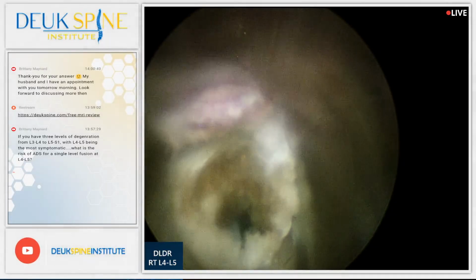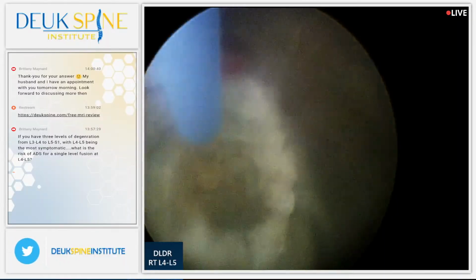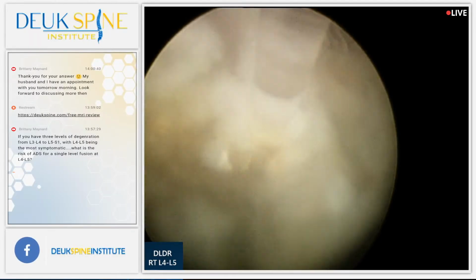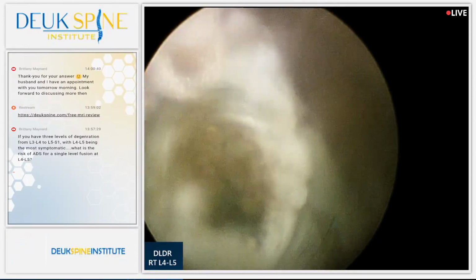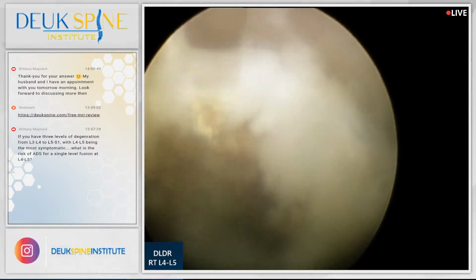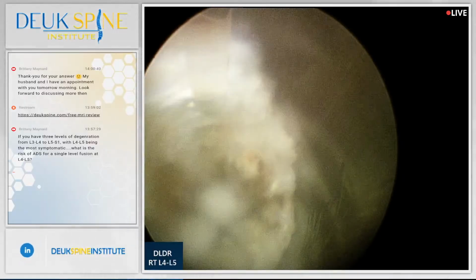this laser that we're using is made in Israel. It's now owned by Boston Scientific. Boston Scientific is a medical device company in the United States, multinational. And basically, they bought the lasers and they paid $1 billion for the laser company and their book of business. And now they've taken the lasers, they've doubled the price of the laser, and they've made the laser fibers 10 times more expensive for us.